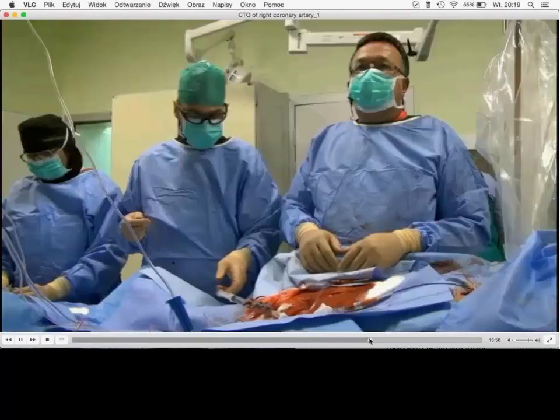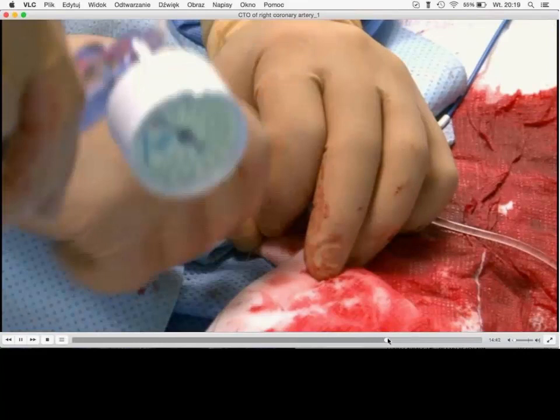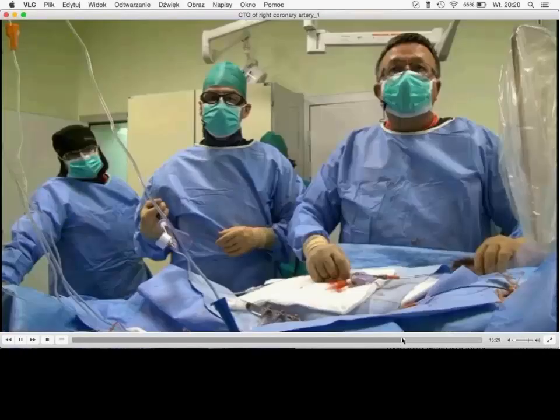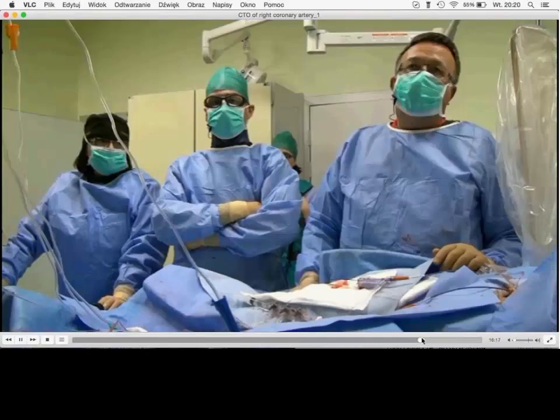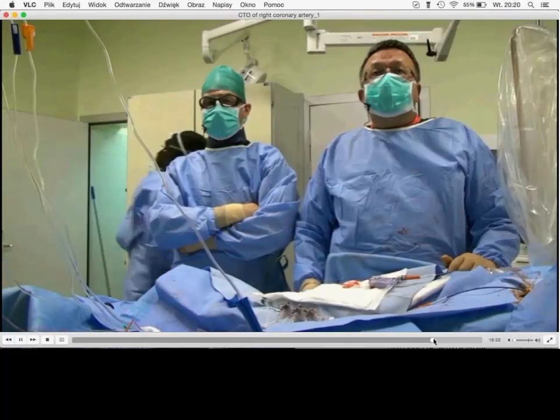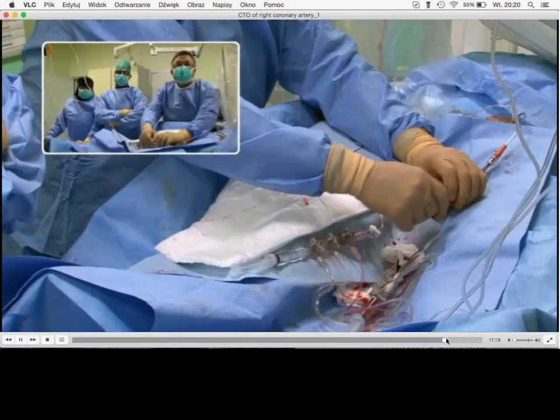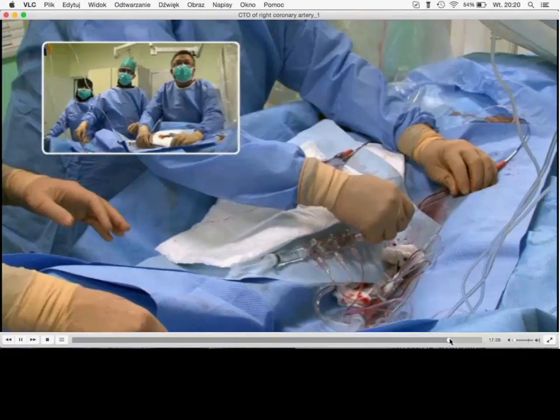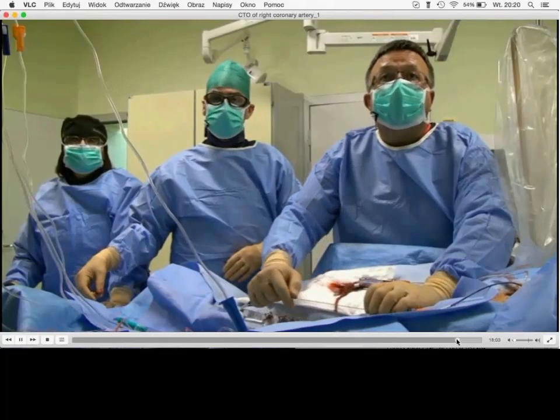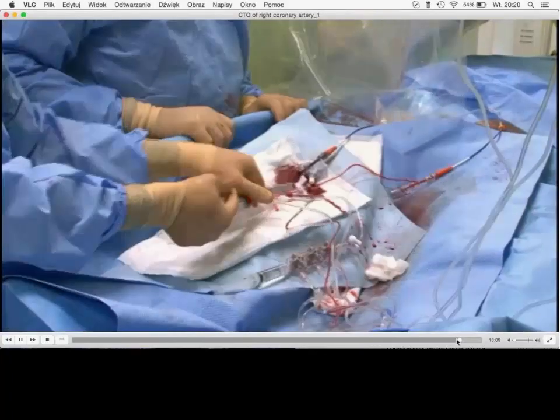And as you will see in a few seconds, we have stented all the vessel with drug-eluting stents. And I will show you the final result. So where is the final result? I will see in a few seconds. This is the remote guide. Is that a typical seven French guide? We work with the seven French guides, even only with the case that we plan to use IVUS.